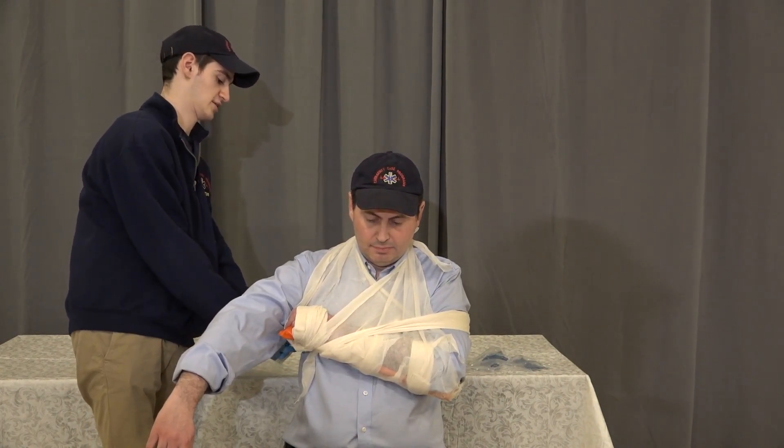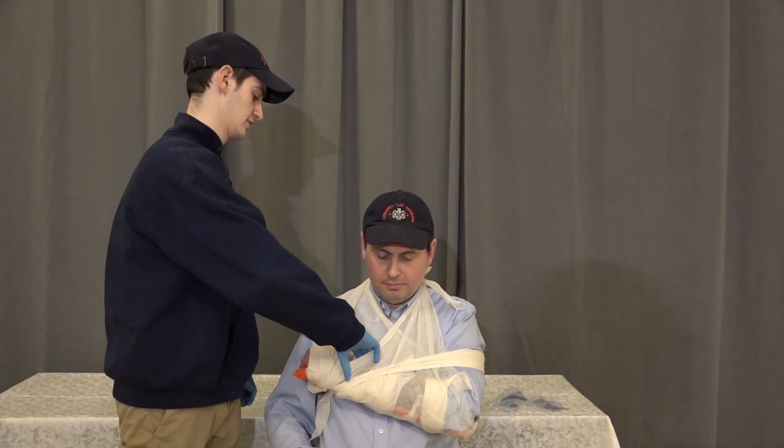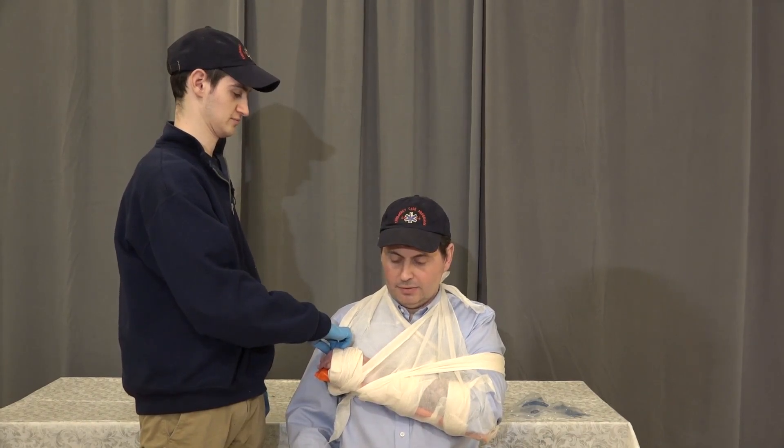Once we've secured that in place, we're going to reassess pulse, motor, and sensory. So radial pulse — wiggle your fingers. Which finger am I touching? The index finger. Okay.